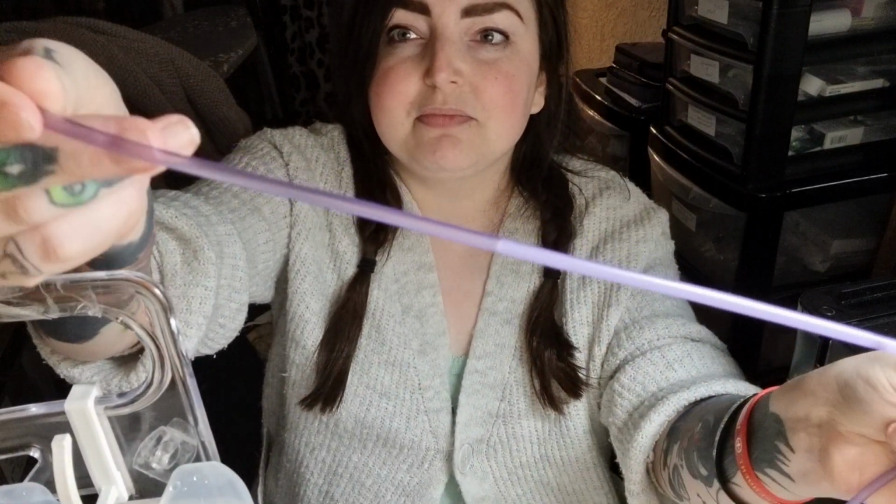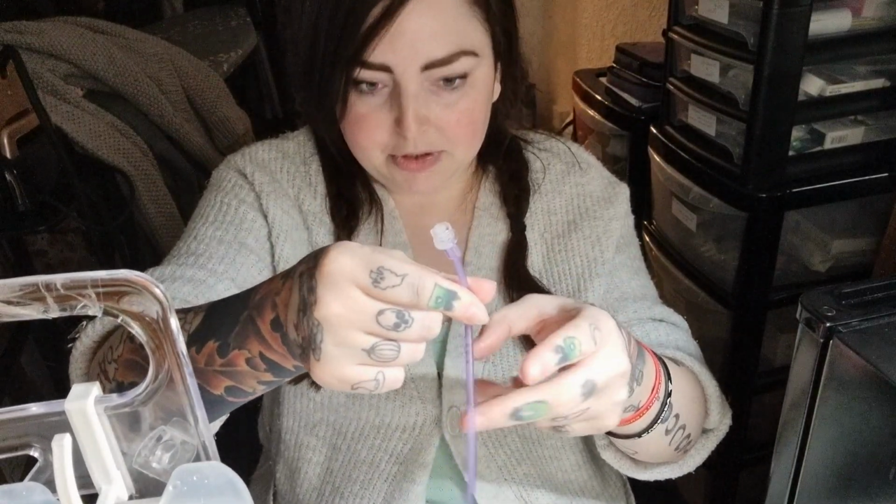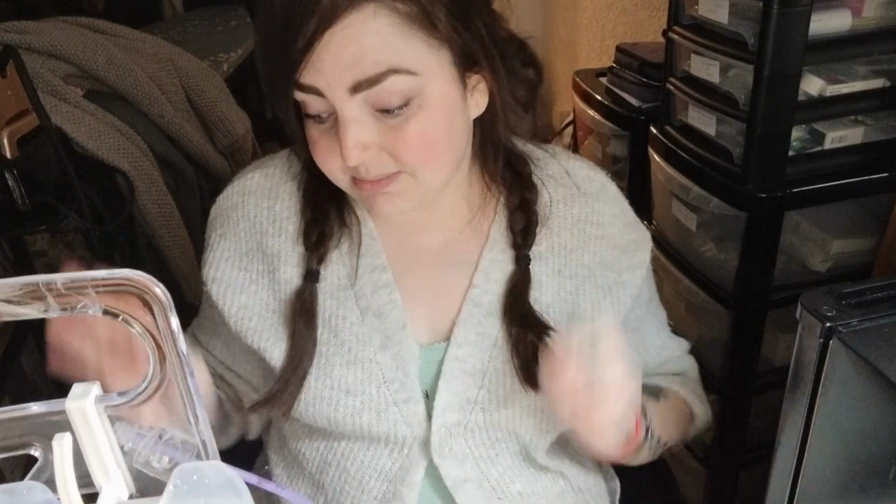So, trademarking it, and that proves that I'm really smart, but also it proves that I'm really unfit because I can't even pick that up. So this hasn't quite made its way around, you see. So you've just got to press the button until it goes up to the top, and you go, no, stop. Actually, wait a minute, why is there bubbles? It's okay, I won't die. It's going into my stomach, it's not going into my veins, so it doesn't matter if there's little bubbles in there.